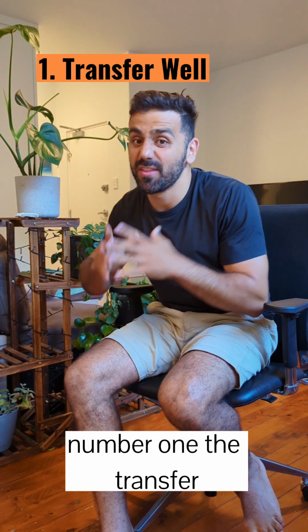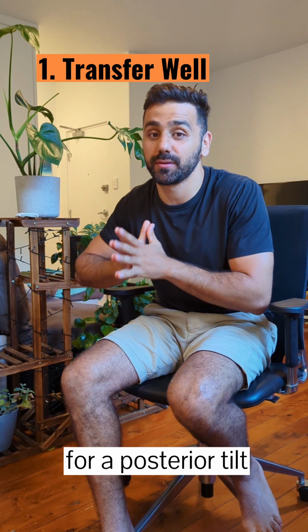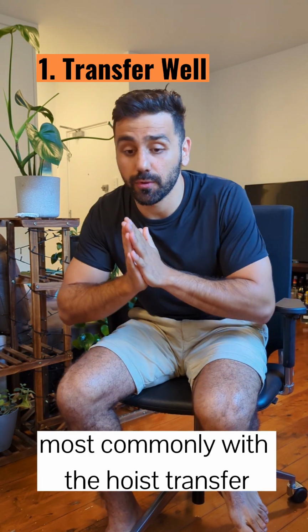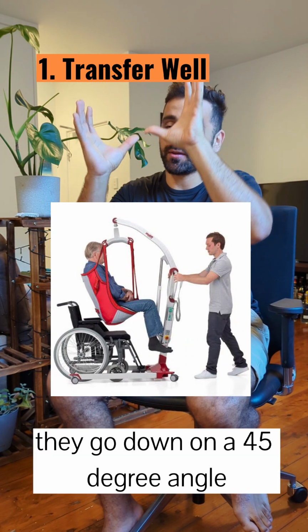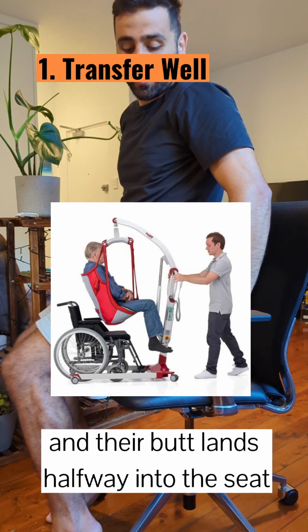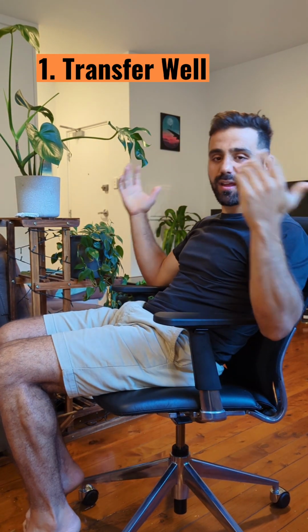Number 1, the transfer. This is probably one of the most common reasons for a posterior tilt. Most commonly with the hoist transfer, because when you picture it, right, they get lifted up into a sling, they go down on a 45-degree angle, and their butt lands halfway into the seat, and then that's it.